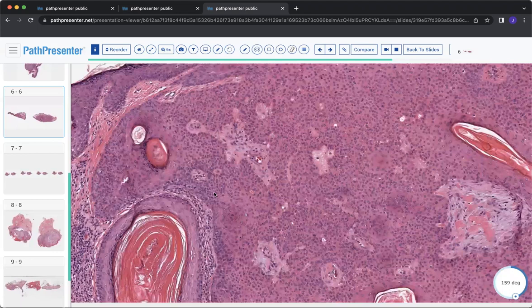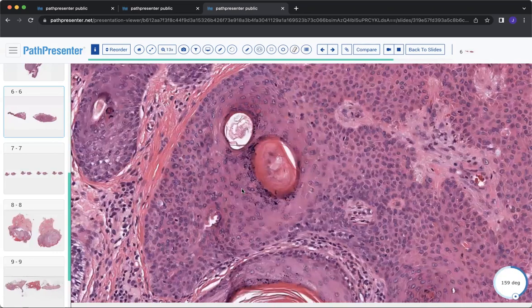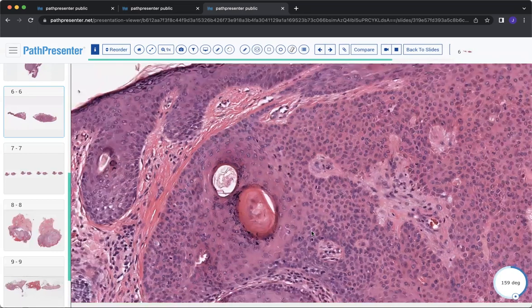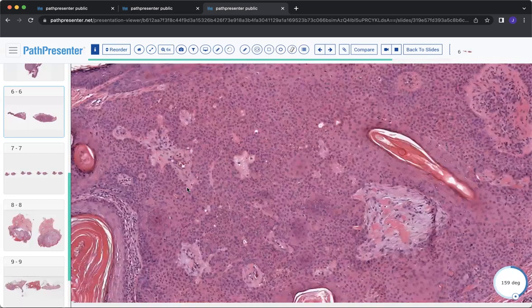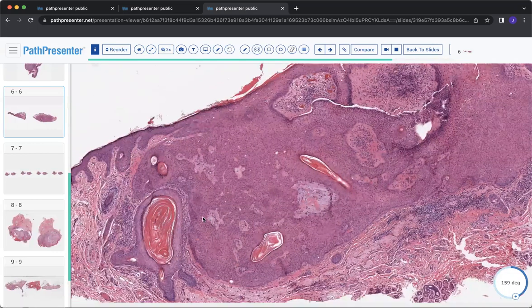Now, when you're taking an exam, you definitely have to use your process of elimination skills. So they're going to give you other choices that are not going to be perfectly fitting. So trichoepithelioma, I'd expect to see a lot more islands than what I'm seeing here. I'd also like to see papillary mesenchymal bodies.